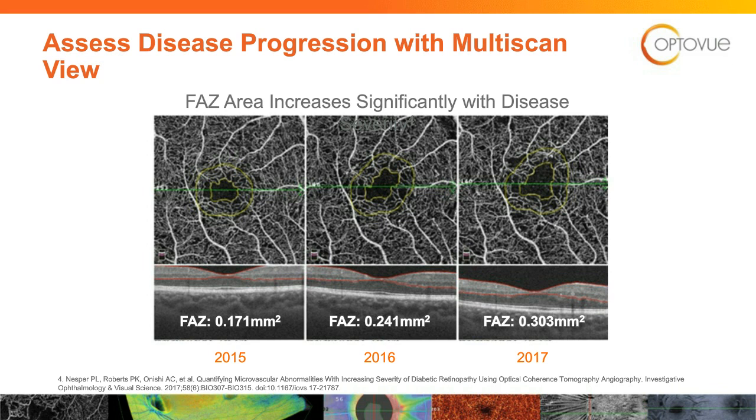Do you scan all diabetics at every visit? We don't scan all diabetics. If they have any degree of vision loss, if they are uncontrolled, if we see any diabetic retinopathy, we will do that. But I am leaning more and more. I've changed my protocol over the course of the last year or so on, boy, even a baseline scan.